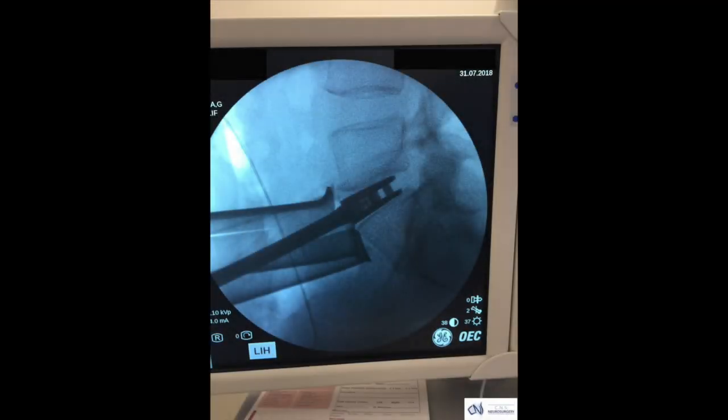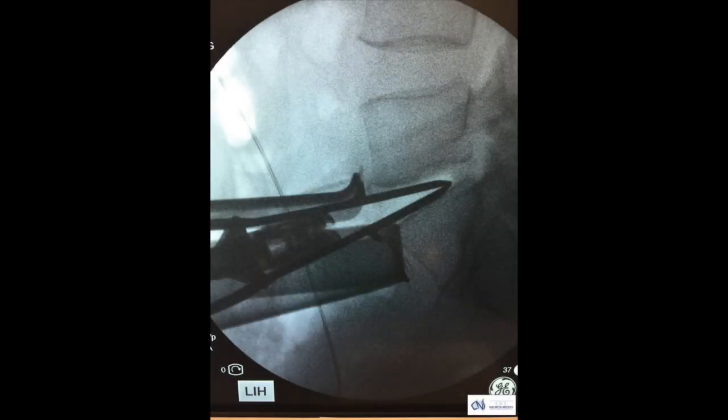This intraoperative x-ray shows the trial, which is a device used prior to placement of the disc to ensure a more customised fit. And here you see an image of the artificial disc being placed along its delivery device.